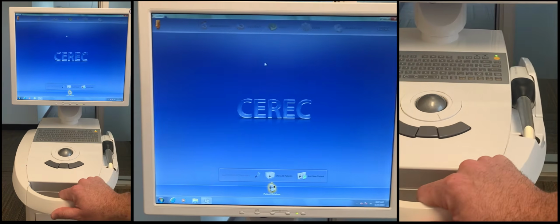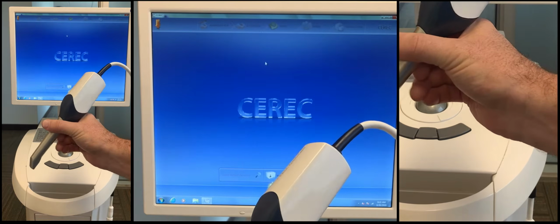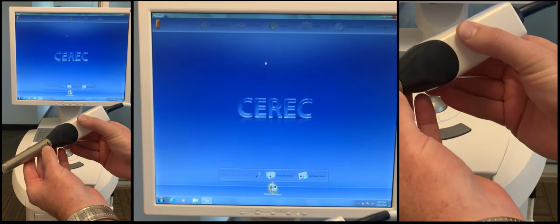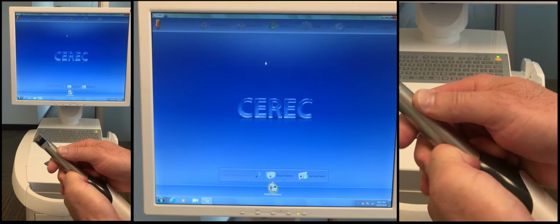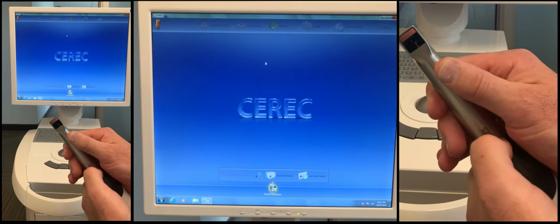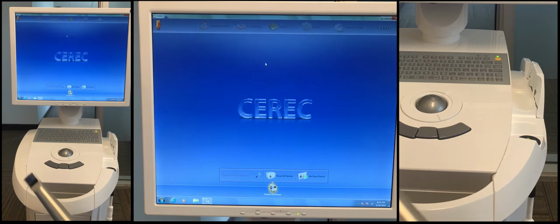So, as I mentioned before, this is the camera. Do not ever drop this camera. Its cost is exceptional. There are little sleeves which can be changed and which should only be changed if necessary. Mine won't come off, which is fine. By an authorized, trained personnel.